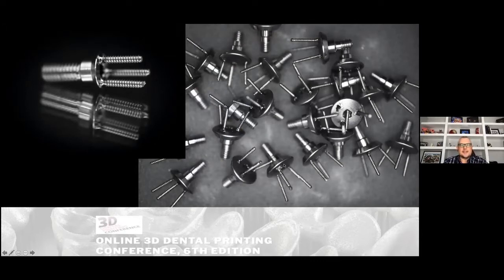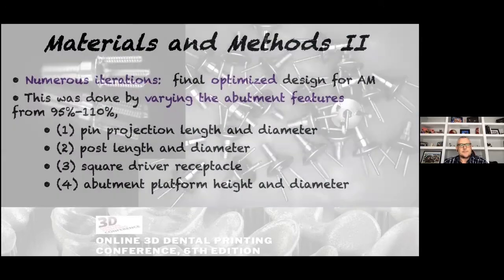What you're seeing on the right-hand side is kind of the samples that we would receive back from a dental lab. So you can see that the angles are totally different, the positions are different, so we have a quality control issue. But having said that, that's just the space that it is in dental device research.